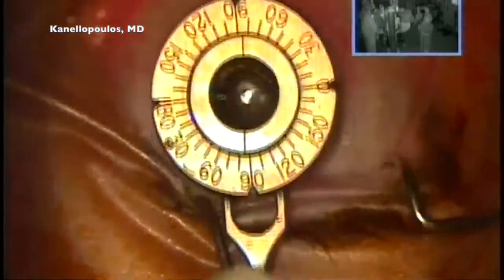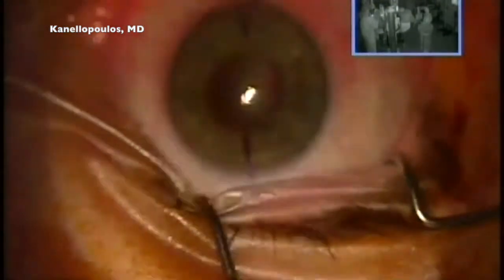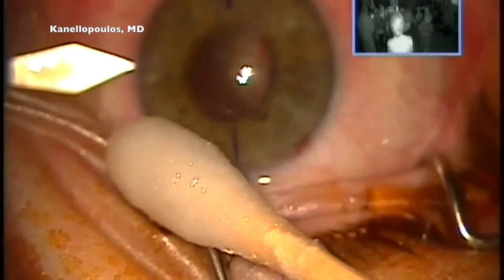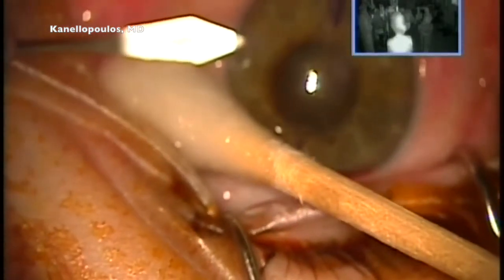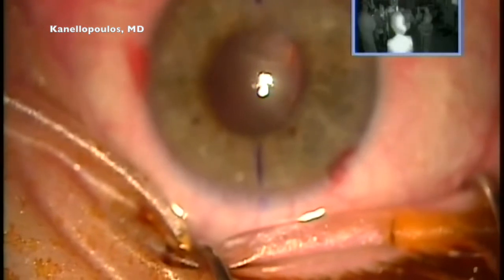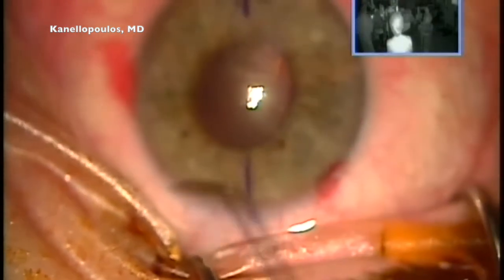Here, with our pictures from surgery, we use the 6 o'clock mark for the 90 degrees, and then define the 2.75 keratome for our main incision at 135 degrees, then using the same keratome for just the 1mm paracentesis. We can see that there are two challenges here. Number one, the pupil is not dilating a whole lot. Number two, we know we're going to run into some problems with the capsulorhexis at the area of the scarring.